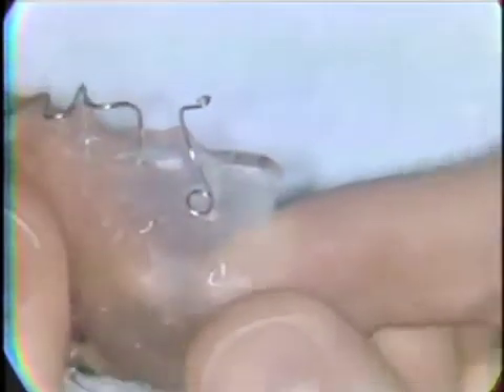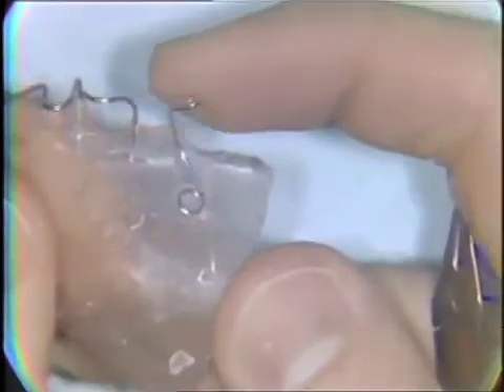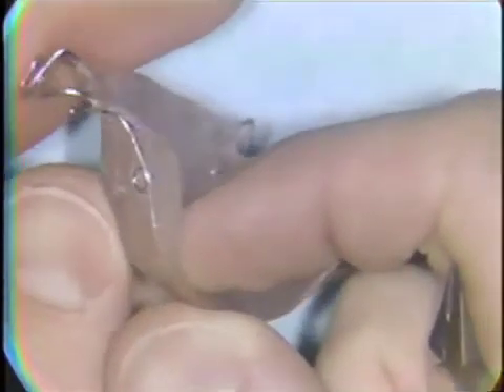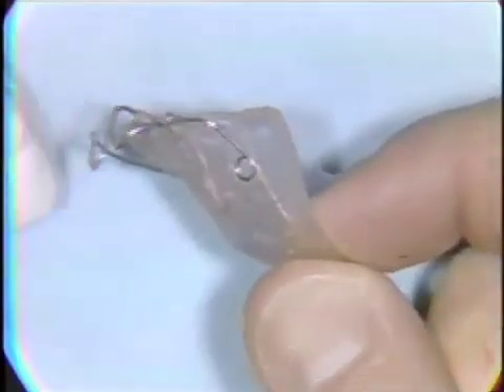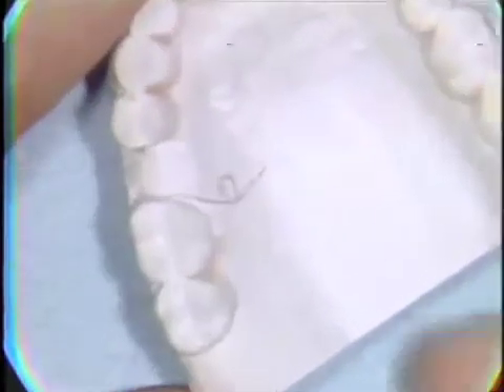Finger springs are constructed from 0.016 to 0.025 diameter stainless steel wire for anterior teeth, and 0.025 to 0.036 diameter wire for posterior teeth. A pencil outline is the important first step in the construction of any finger spring.